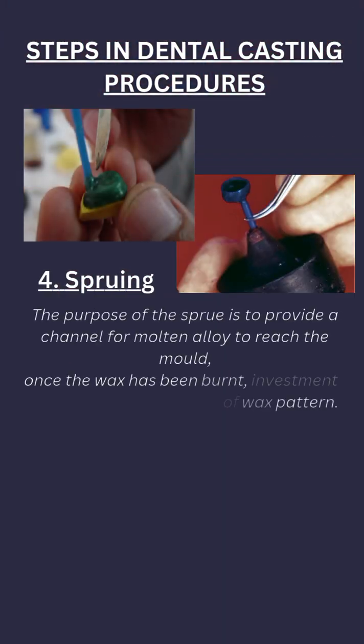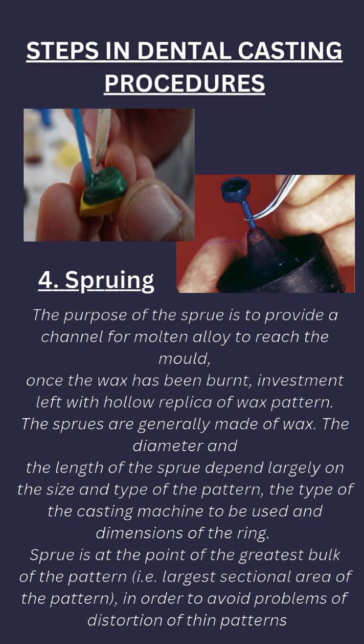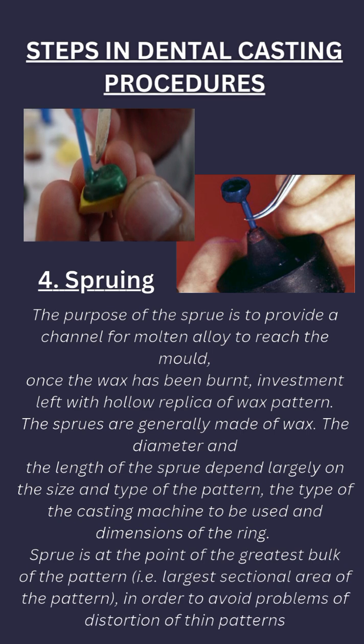Sprue technique: the purpose of a sprue is to provide a channel for molten alloy to reach the mold. Once the wax has been burned out, the investment is left with a hollow replica of the wax pattern. The sprues are generally made of wax.